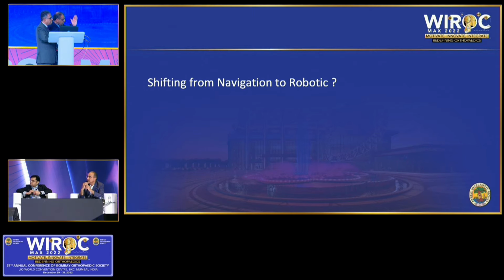And what about coronal plane? You mentioned. Coronal plane, of course, it's better control. And most important we have observed is that almost always we put a 9mm poly. That's the thickness of the poly is reduced. So there is no surprise opening of the gaps. There is minimal over release. So all those fine adjustments to coronal and sagittal plane as well.